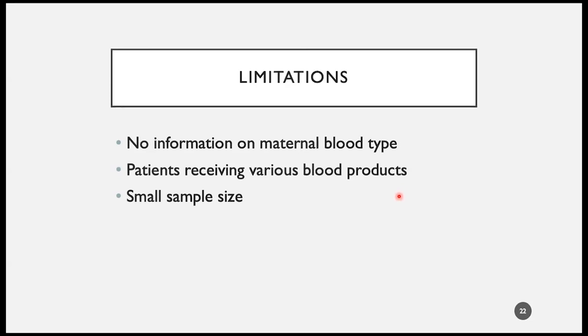Oftentimes, when you're doing research on clinical specimens, you have to be mindful of when the samples were collected and if the patients were administered any products that could affect our analysis. Again, we're still collecting this data for all of our patients from our clinical transfusion records. And lastly, we had a fairly small sample size since we're looking specifically at pediatric heart transplant patients.